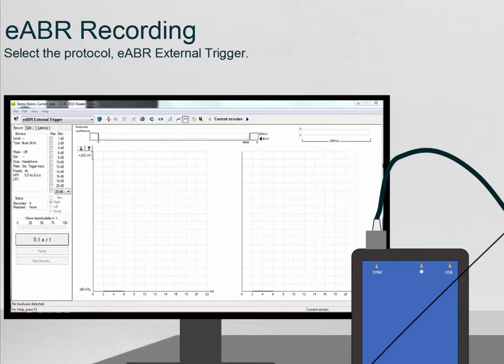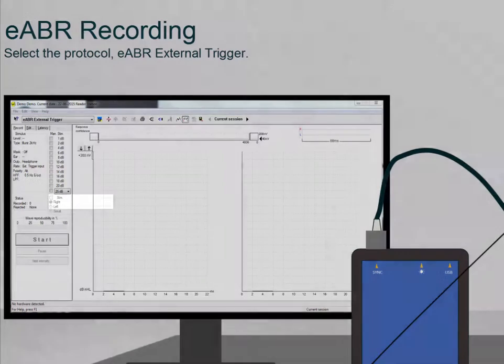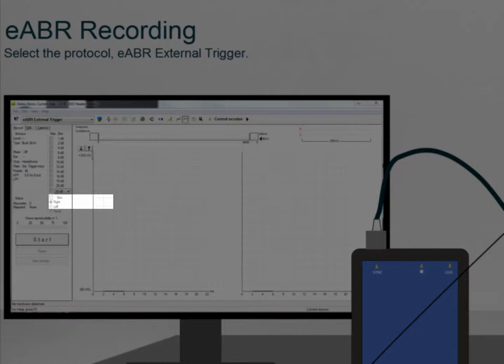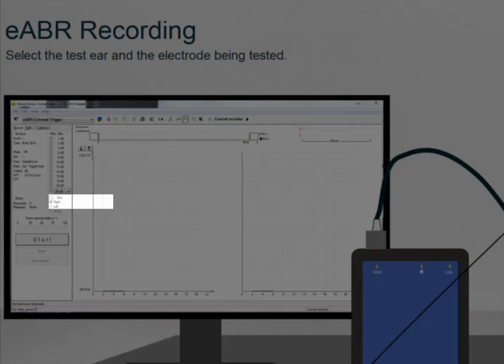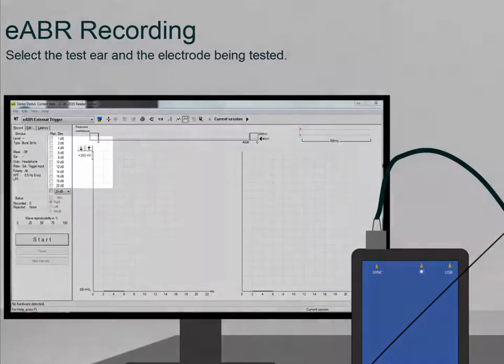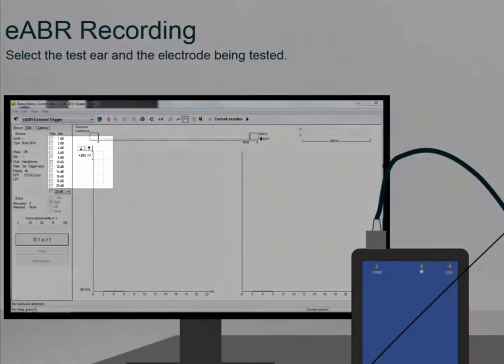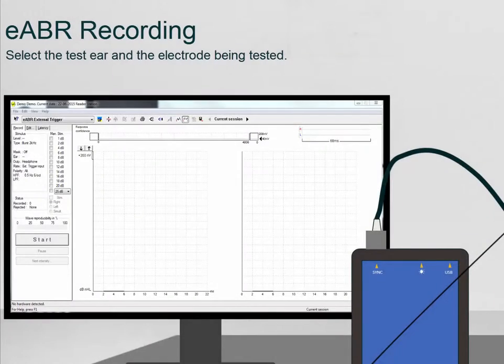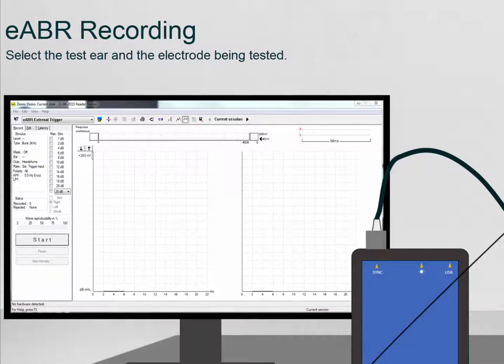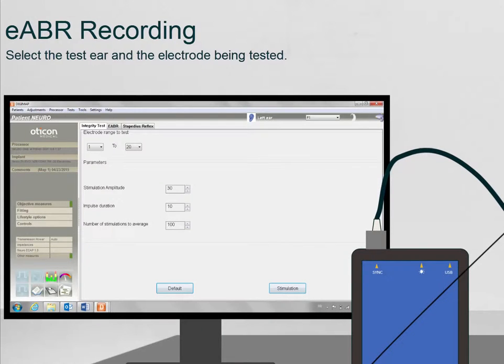After this, select the test ear and the Cochlear Implant electrode band for testing. The Cochlear Implant software will only stimulate one electrode band per time in eABR mode.